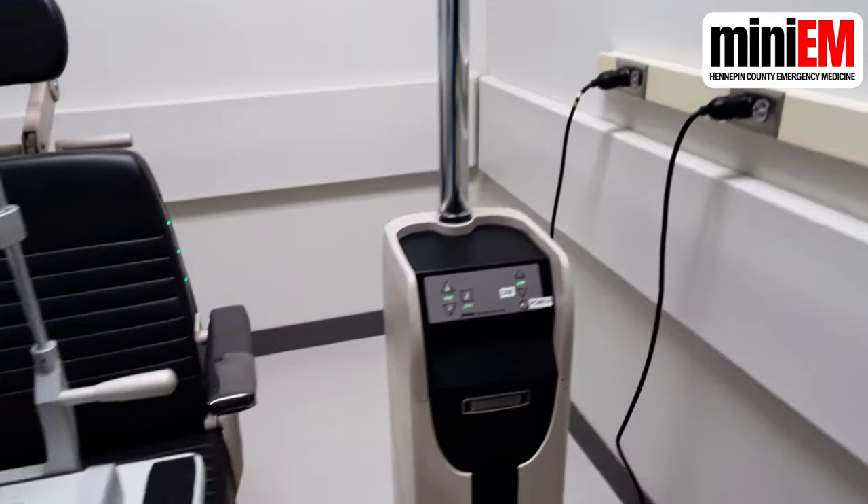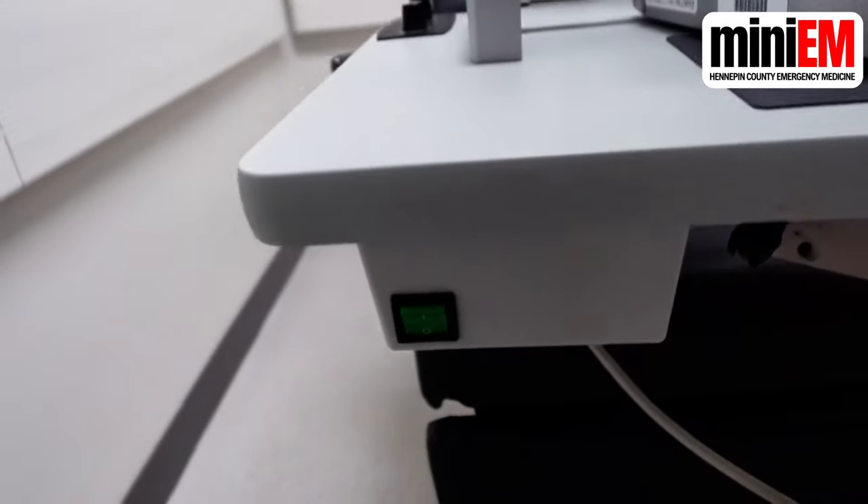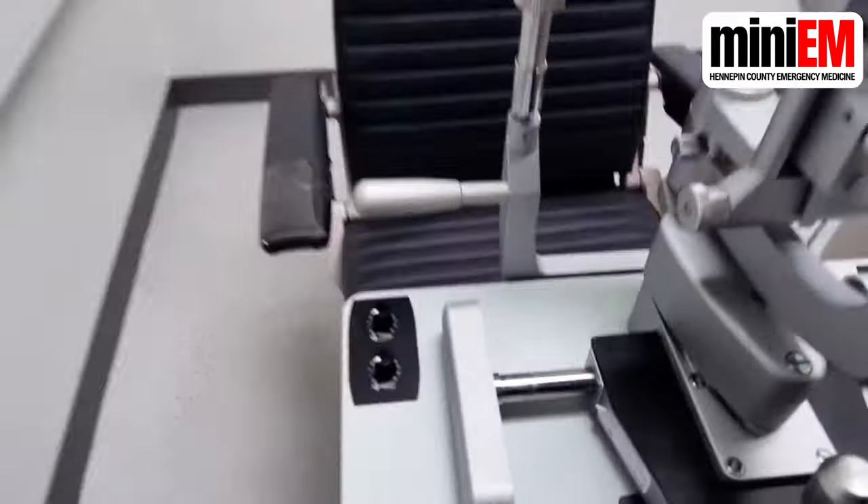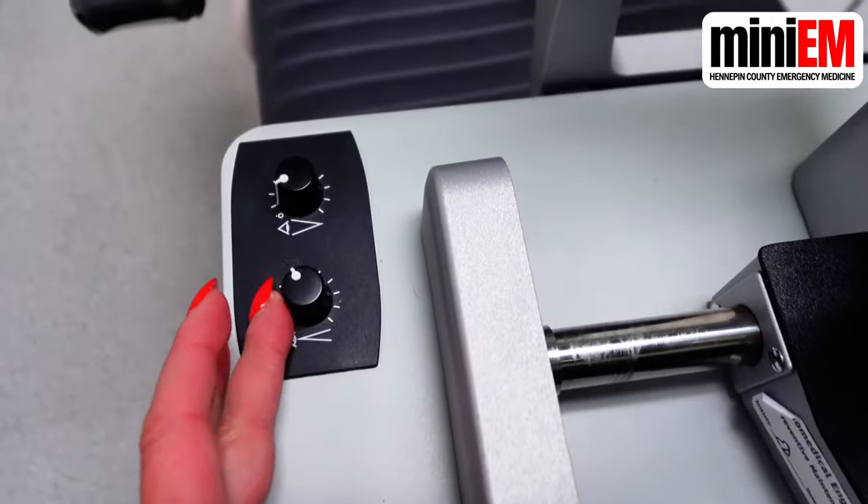Make sure the lamp itself is plugged into a wall outlet, and there should be an on button on the table, so switch that on. Turn both of your brightness dials all the way up, and you can always dial them back later.